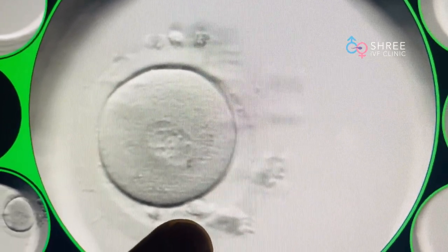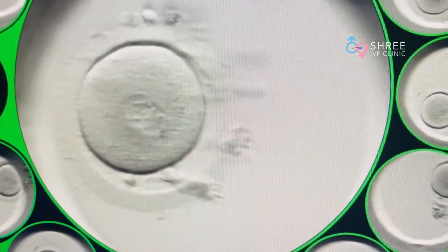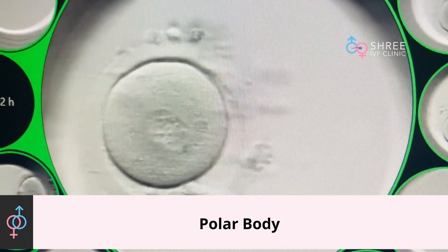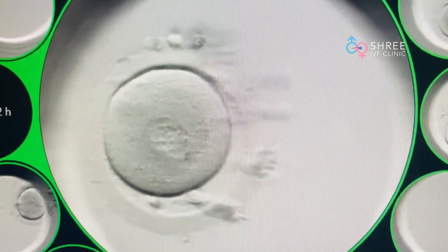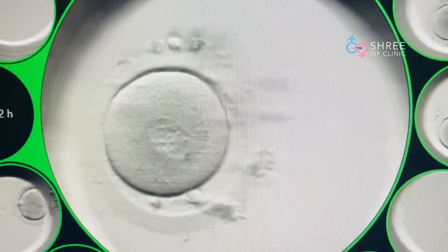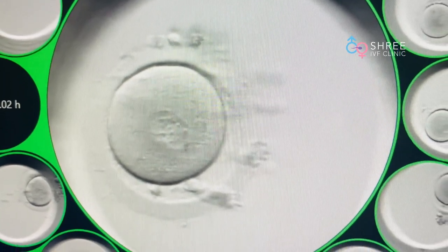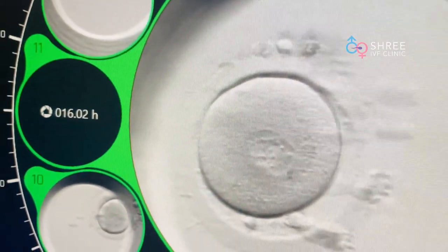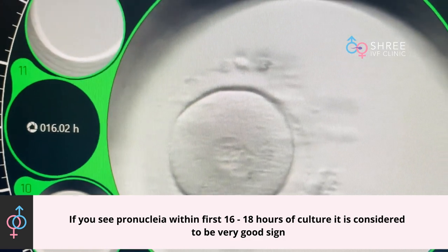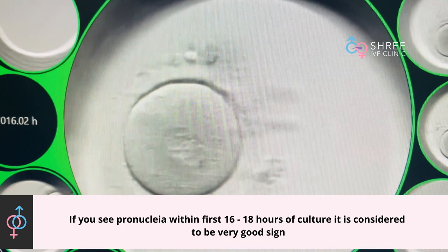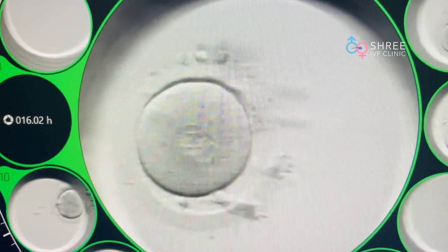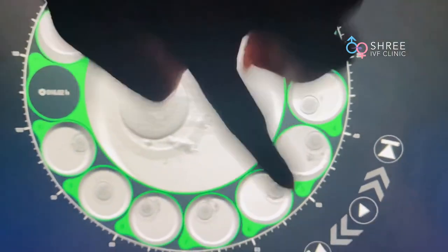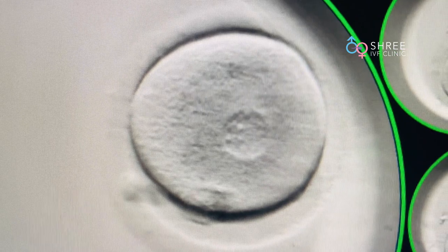When looking at the pronuclei, it is very important to also assess this small circle — you can see it here. This small circle is called the polar body. As a patient, one must remember that as an embryologist or ART specialist, we are looking at certain characteristics inside this 2PN stage. The first thing is timing: this patient has undergone approximately 15 hours of culture. Seeing the pronuclei within the first 16 to 18 hours of culture is considered a very good sign.